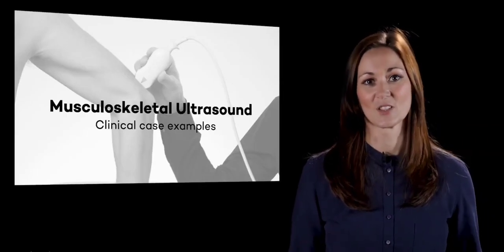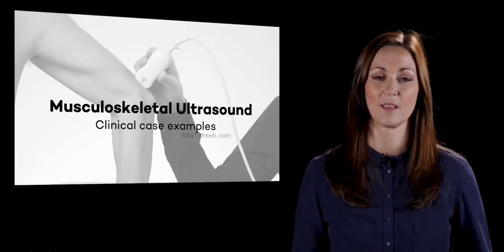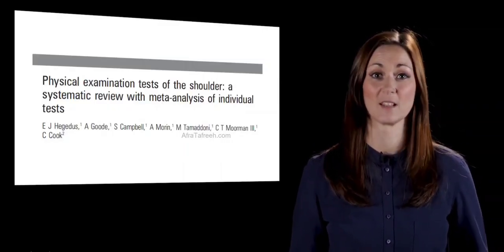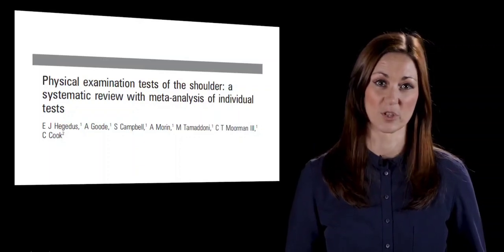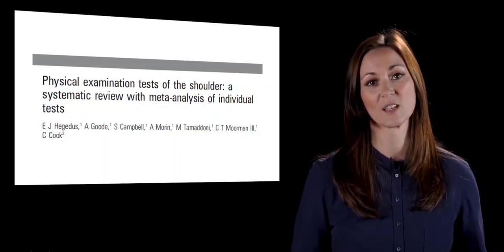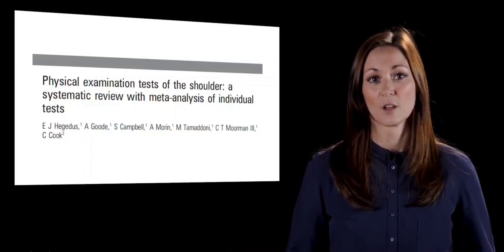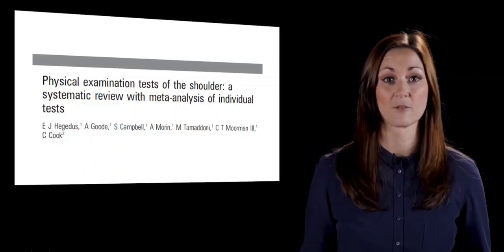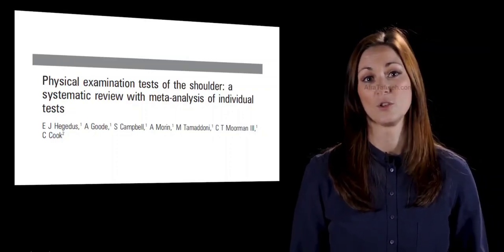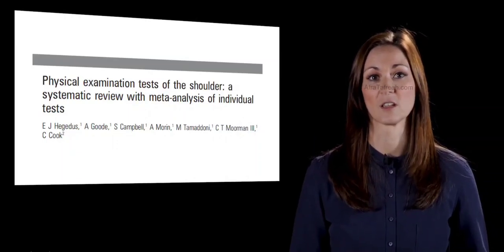The goal of this presentation is to show you some different images of supraspinatus pathology. An accurate diagnosis is not that simple due to the complexity of the anatomy and biomechanics of the human body. High-quality research shows that in plenty of cases, the diagnostic accuracy of the physical examination we do is limited. Currently, almost without exception, there is a lack of clarity with regard to whether common orthopaedic special tests used in physical examination are useful in differentially diagnosing pathologies.